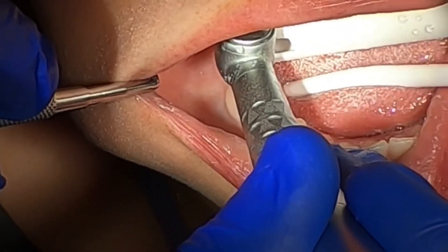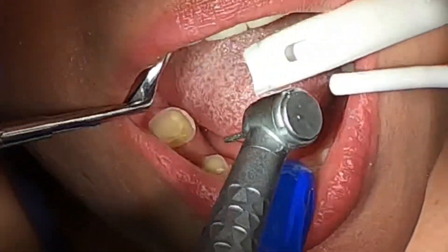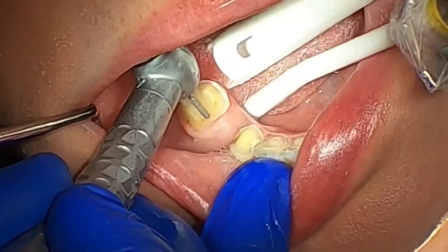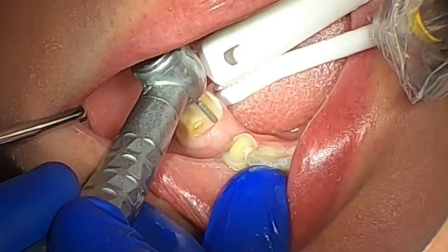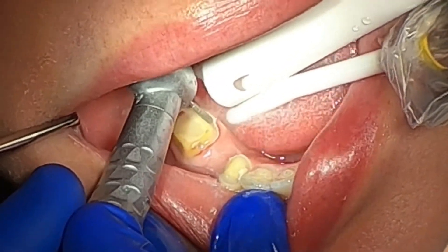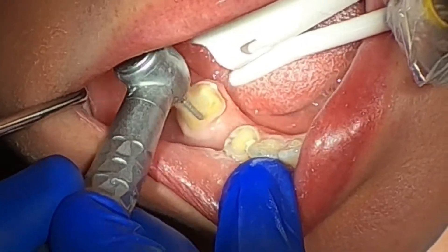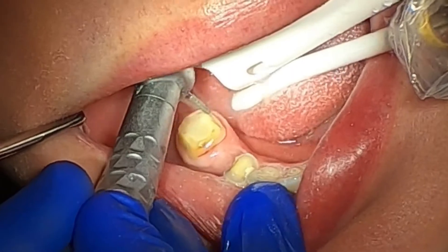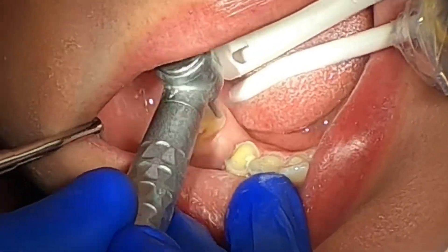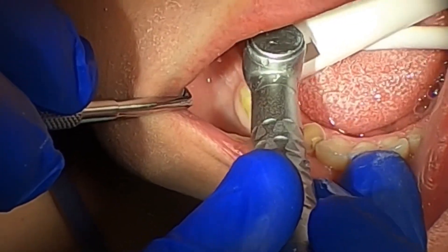The elapsed time on the preparation was roughly 10 minutes give or take. Immediately after this preparation video it'll jump into a screen recording of the bridge design. For this whole appointment we allotted three hours. The patient was in the chair for about 90 minutes at the beginning, then there was roughly a one-hour delay while the machine was milling the bridge and we were firing it in the furnace. Cementing took 45 minutes plus a post-op x-ray and occlusal adjustment — so maybe three and a half hours total.